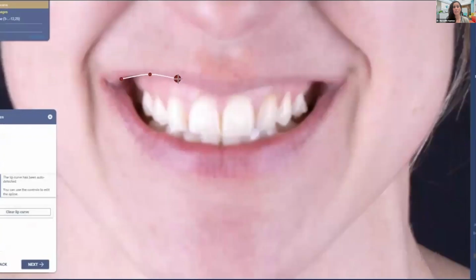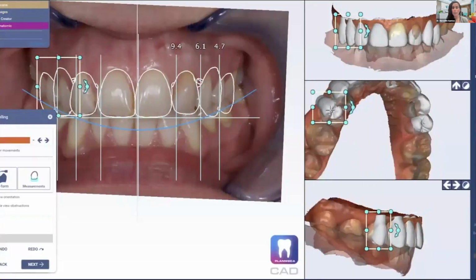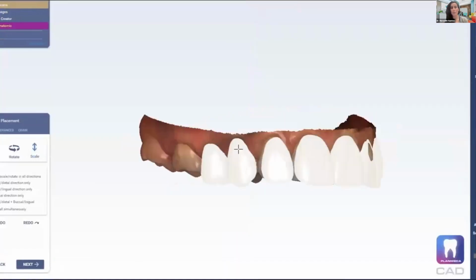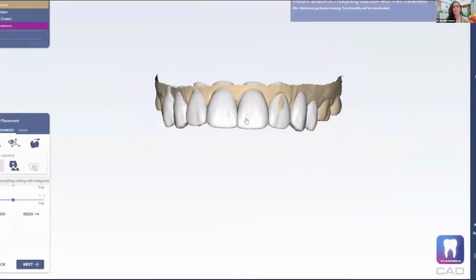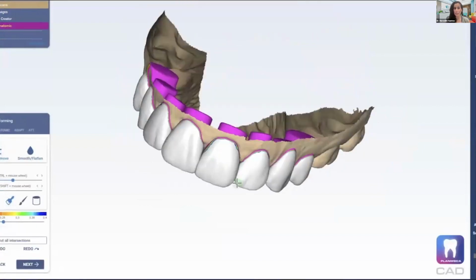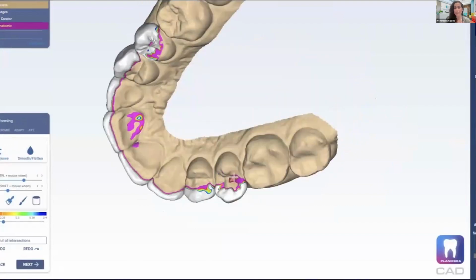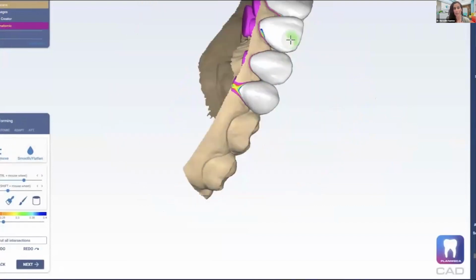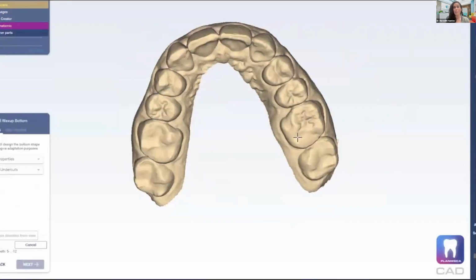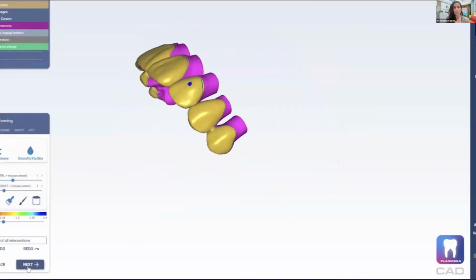It's the same way that we would do it, where we can take those pictures, we can take the scans, we can overlay it, and we can design something that we're then able to pop onto her teeth or bond onto her teeth for a short amount of time and really be able to illustrate to mom why we feel like the ortho is important. Because to me, when I worked Lizzie's case up and I'm looking at all the things that I want to correct in Lizzie's case, I can't do that with just a restorative solution. And mom's really driving that for a restorative type of solution. So this is super helpful.